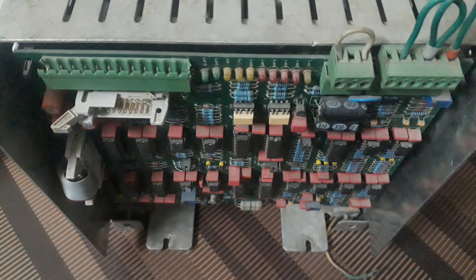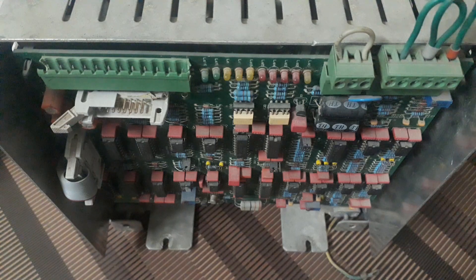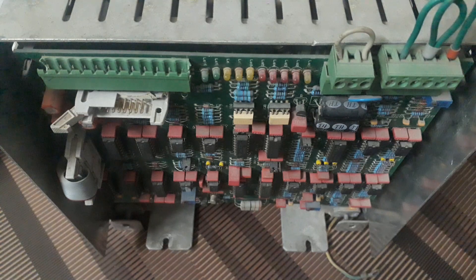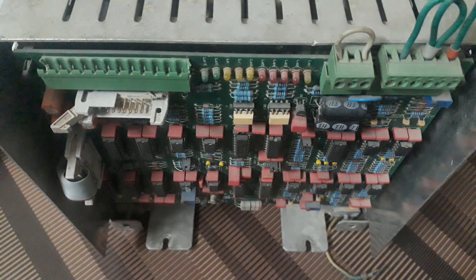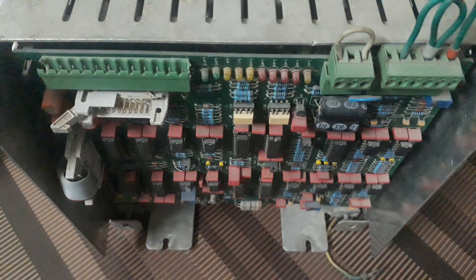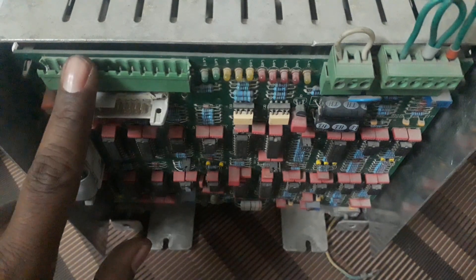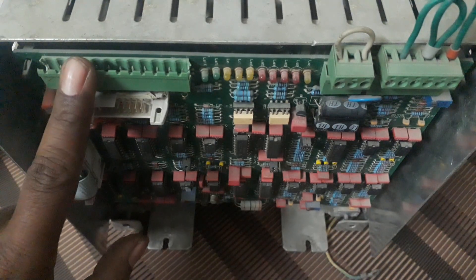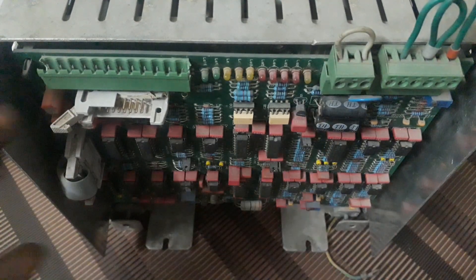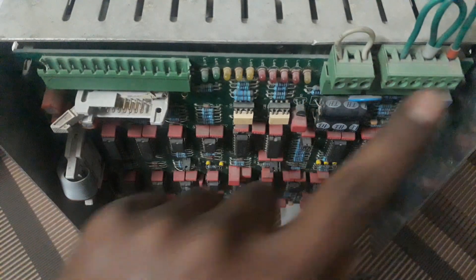Today I'm going to tell you about the IMD generator and its connections — especially CP1, CP2, and CP3. This is the CP1 connector, this is the CP2 connector, and this is the CP3 connector. The connection numbering starts from left to right in each connector.